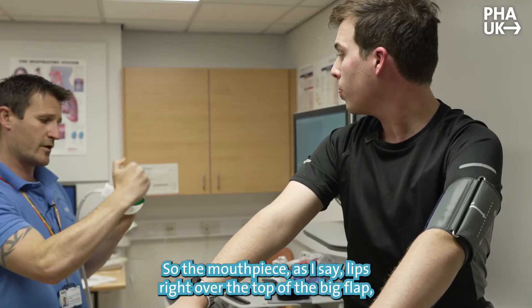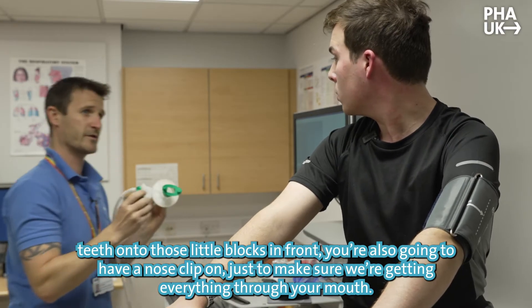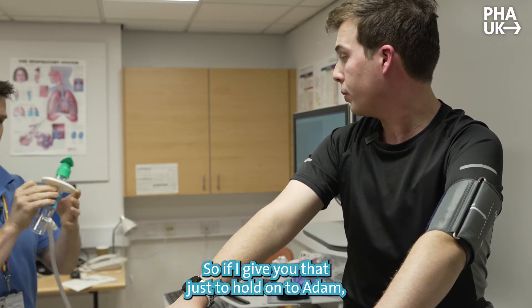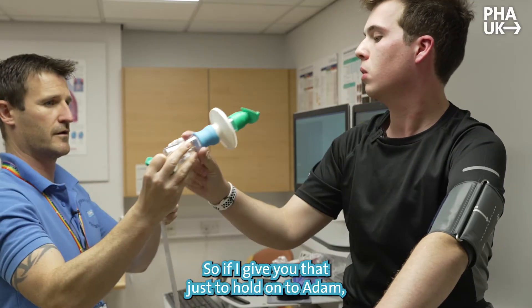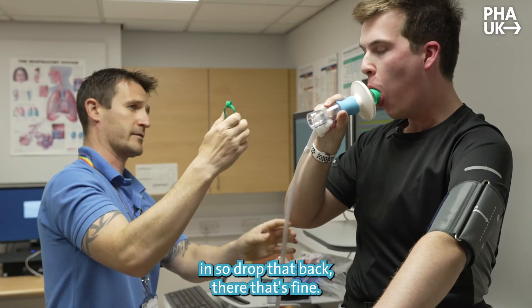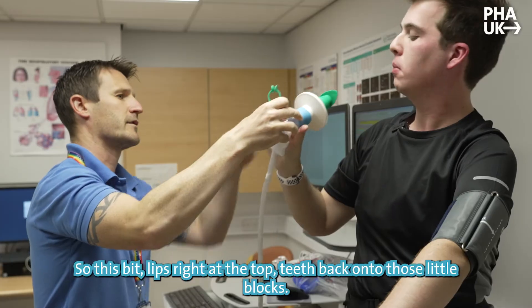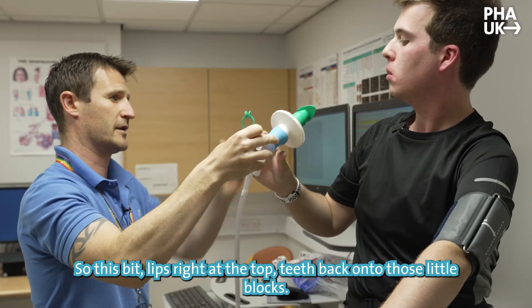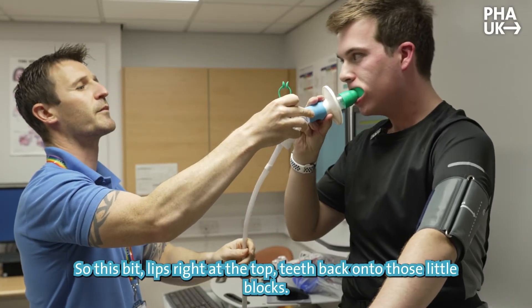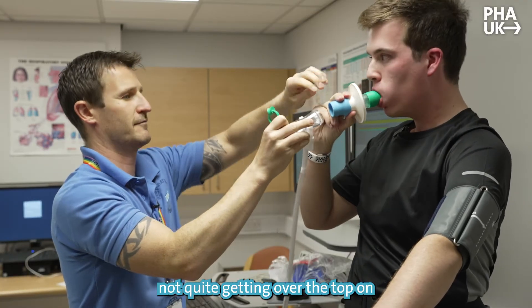Mouthpiece-wise, lips right over the top of the big flap, teeth on the blocks in front. You're also going to have a nose clip on just to make sure you're getting everything through your mouth. Lips nice and tight — it's probably a bit too far in, just come back a little. So lips right over the top, teeth back on the blocks. Pop the corners in first — that's it, that's fine.